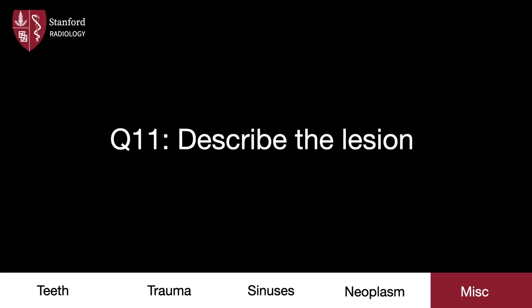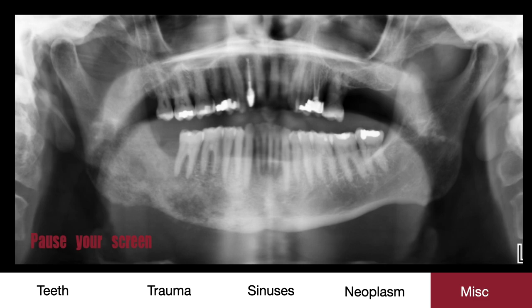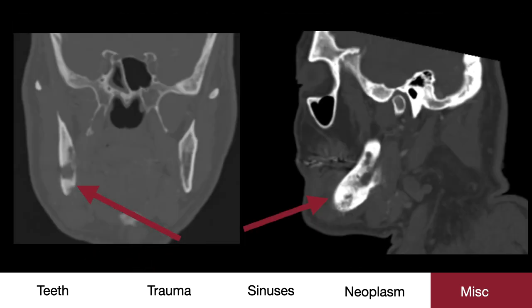Second to last case — describe this lesion. In the right mandibular ramus, angle, and body, there's a patchy sclerotic area compared to the left. This very well could be a neoplasm as seen earlier, but note how this category has changed to miscellaneous from neoplasm. This patient actually had bisphosphonate-induced osteonecrosis.